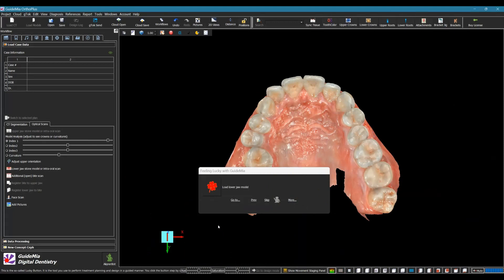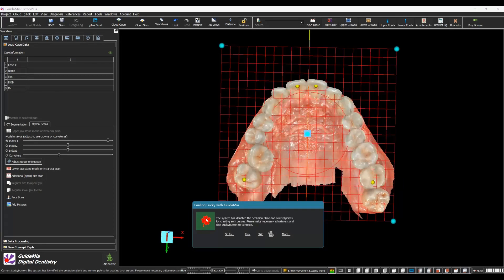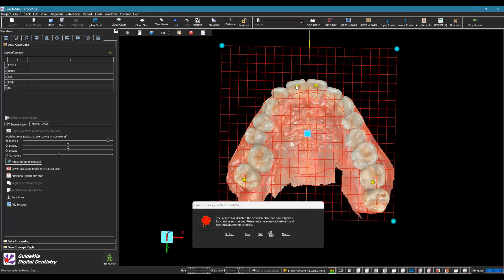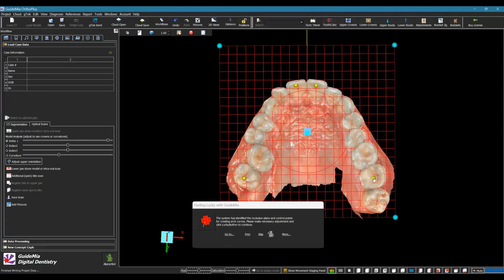Load the lower jaw model — the system will try to locate the lower jaw scan by matching file names. If it fails, you'll need to choose the file manually. This is the Lucky Button — the tool used to perform treatment planning and design in a guided manner. You click step by step to finish your workflow, and the instructions next to the button tell you the details of the current step and what's next. The system has identified the occlusion plane and control points for creating arch curves. Normally you'll see two spherical handles on the upper incisors — make sure they're on the midline of the lingual surface.